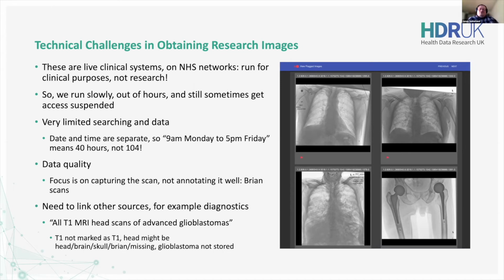So within Pictures, we have a research project underway to help address that and try to identify the body part in each scan. On the right here, you can see some images that were submitted to the National COVID Chest Imaging Database. Medical technology might be able to see why the bottom right set of lungs doesn't work very well. It seems to have a pair of hip replacements in it. But that was submitted to us as a chest X-ray. So quality control can be something of an issue.